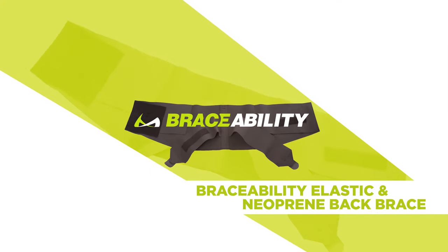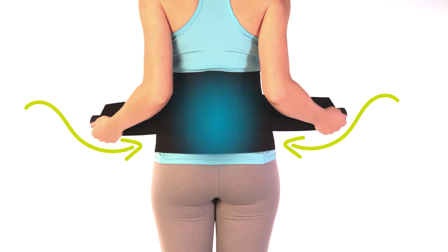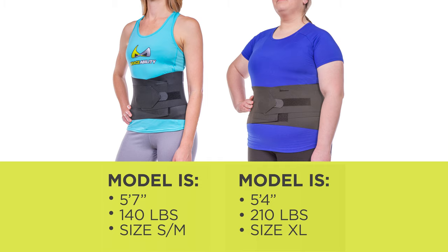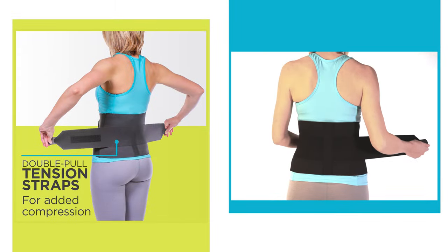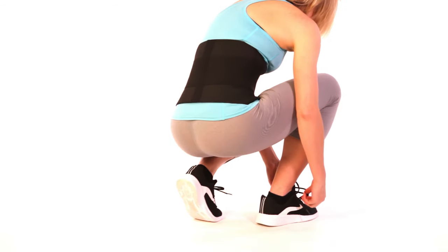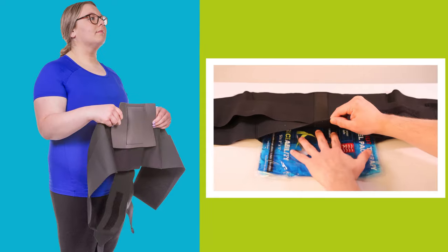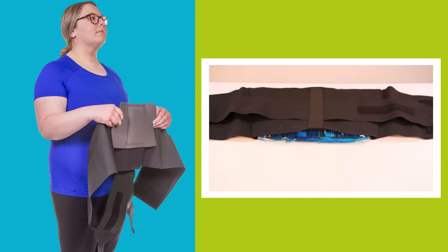Braceability elastic and neoprene back brace provides targeted lower back and lumbar support, available in a variety of sizes fitting average to plus size men and women. Features double pull tension straps for added compression, lightweight and comfortable medical grade elastic and neoprene material for all-day comfort. The back pocket holds a cold and hot therapy gel pack or foam pressure pad.